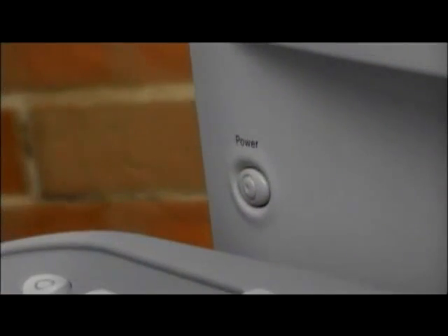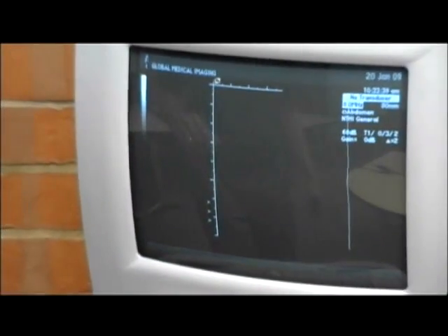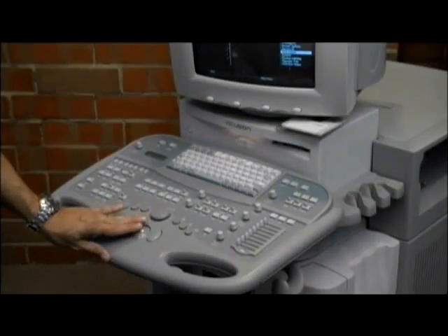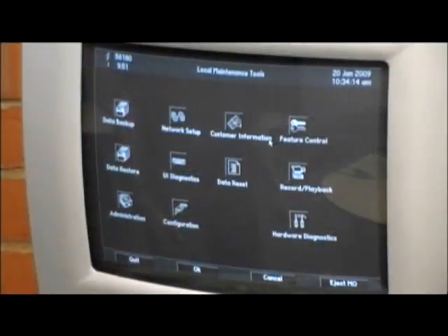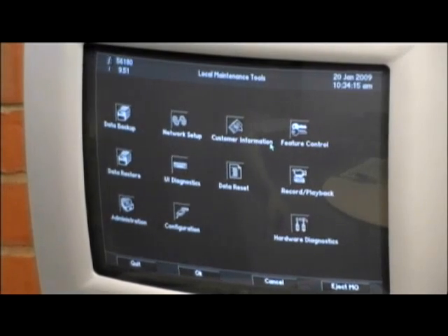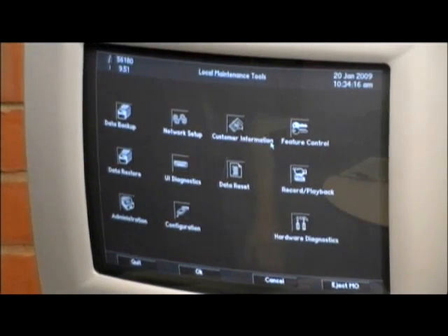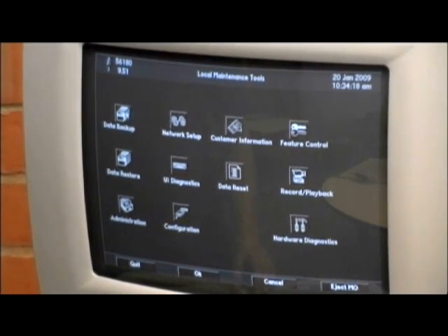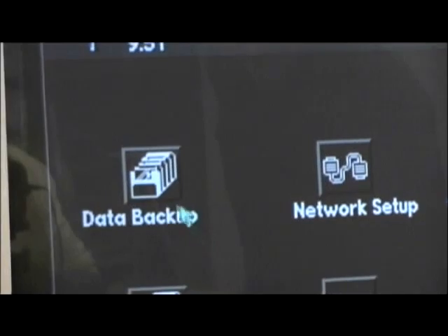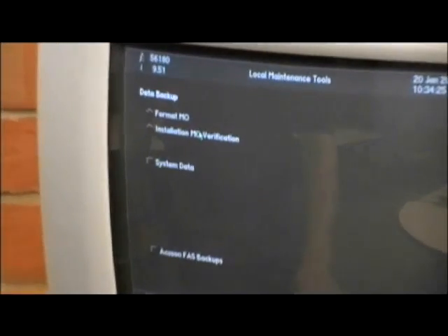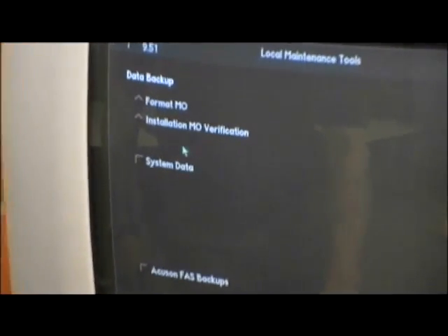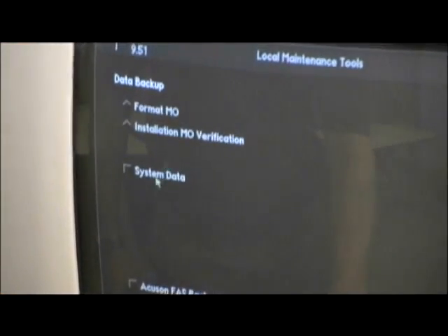Turn the machine on. This will bring up the imaging mode on screen. From this screen you should go to the system user interface, or SUI. Once you are on the SUI screen, click on the data backup icon. This will take you to the data backup screen.